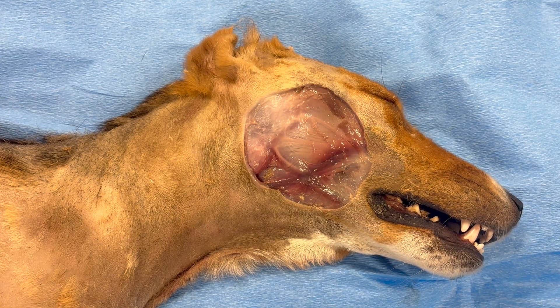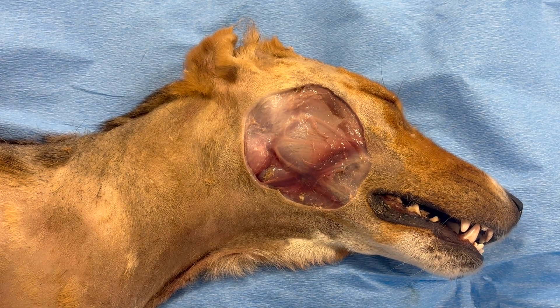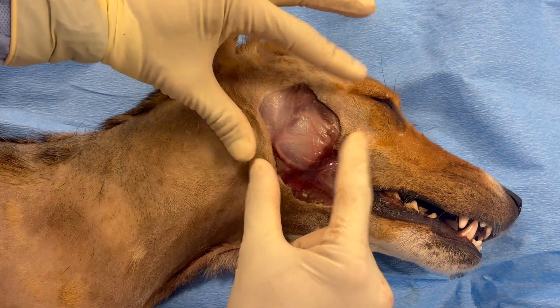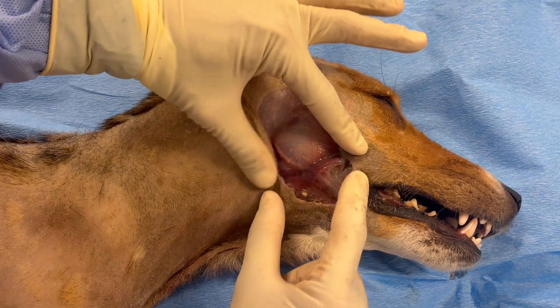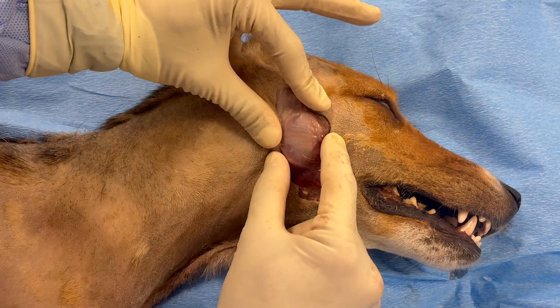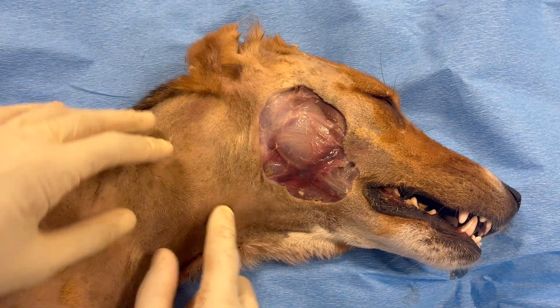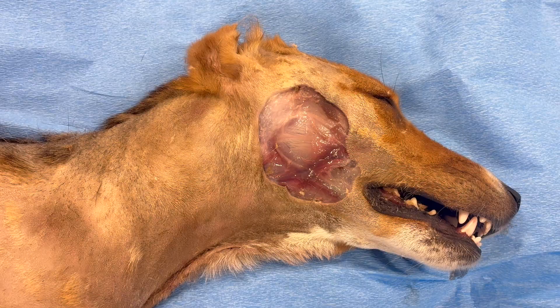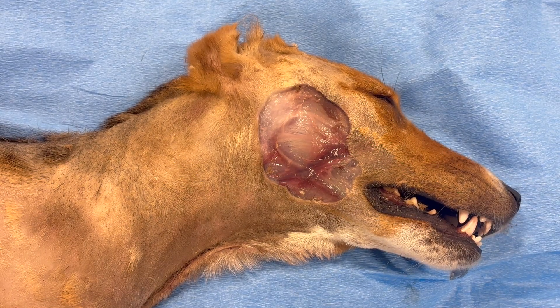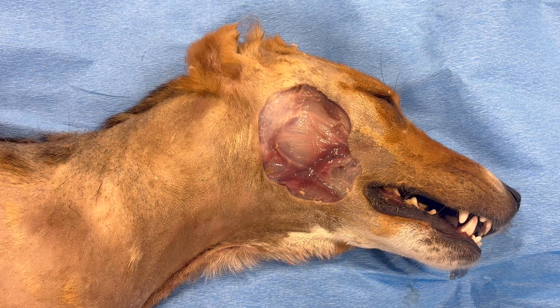In this lab we will create a large cheek wound to demonstrate the pros and cons of a single pedicle advancement flap. You can see that if we try to close this wound primarily there'll be a lot of distortion and tension, and that distortion could affect the mouth and the eyelids.